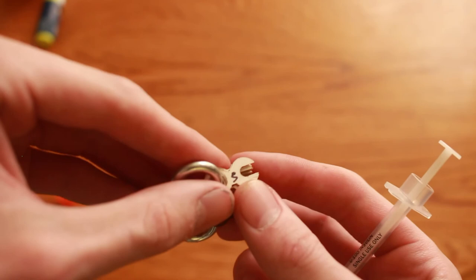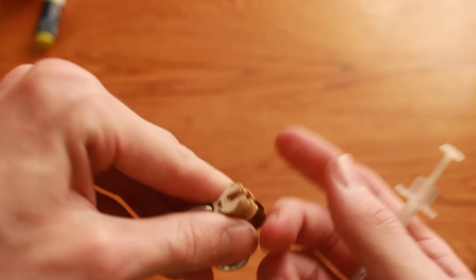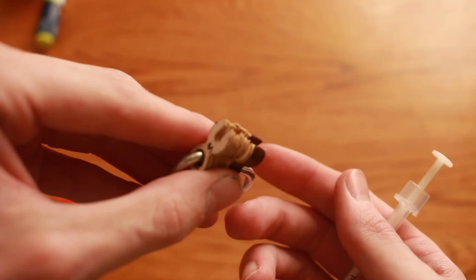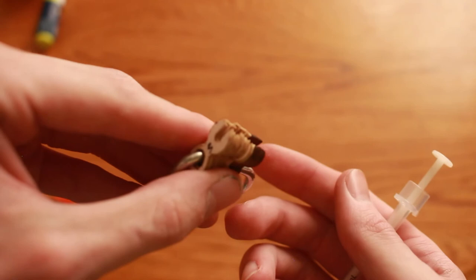It might be a little more than 0.25, might be 0.27, but still close enough to basically give you a quarter of a unit, half unit, full unit, whatever as much as you need. Whatever you need consistently and you'll be able to reuse the syringe multiple times in a row.